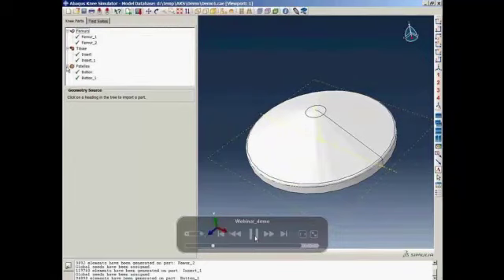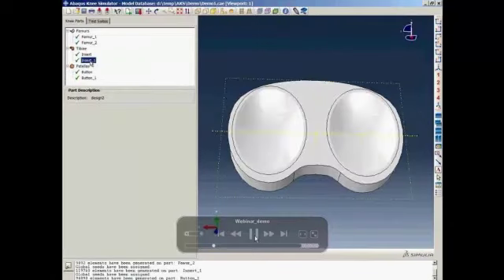Once the implant parts have been imported successfully, they will have a green check mark next to them in the knee part tree. The user can choose to edit the surface and landmark points if they happen to pick the wrong surface or the wrong points. And they can also swap the dwell points if they mistakenly enter the lateral side for the medial side. They can do it here.